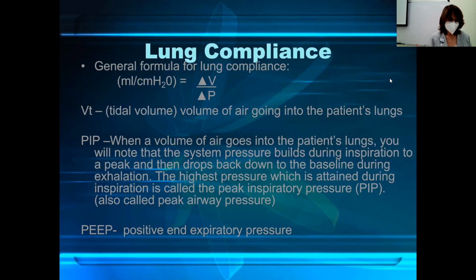And we have a lot of information coming up on PEEP, but just for now, it's just a baseline pressure. Like you keep a little bit of a positive pressure in the patient's lungs all the time when they're on the ventilator. And we'll talk about why in a little bit.